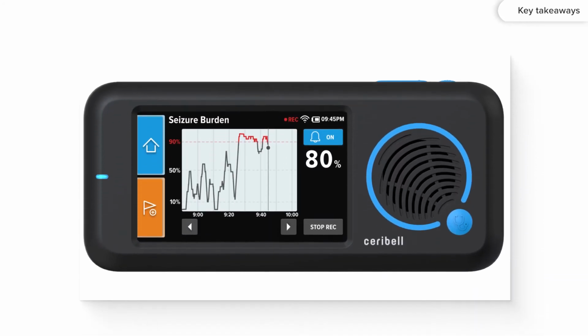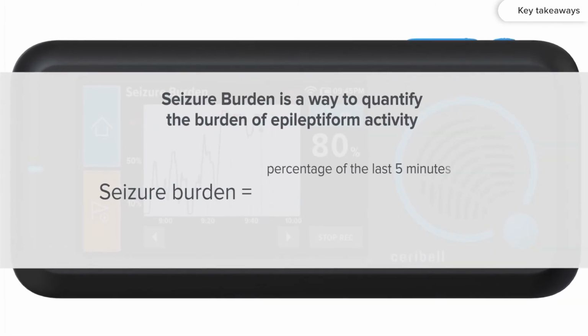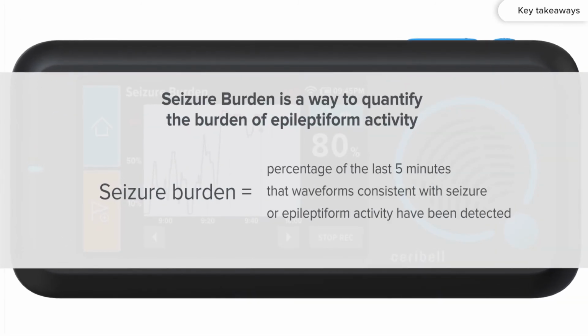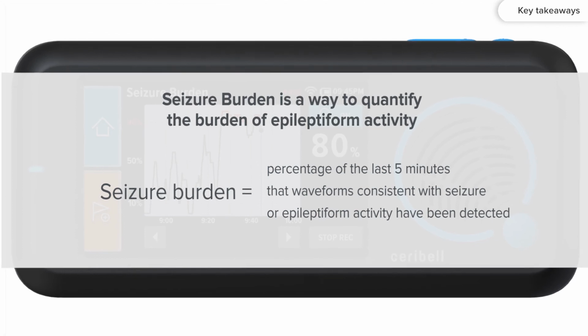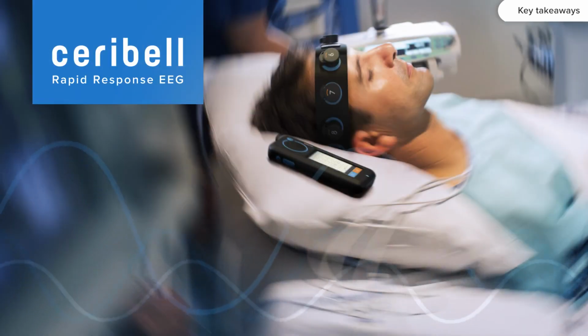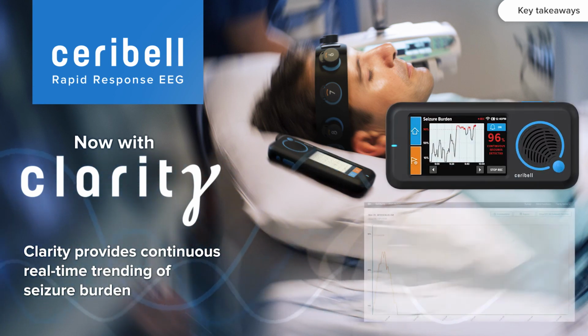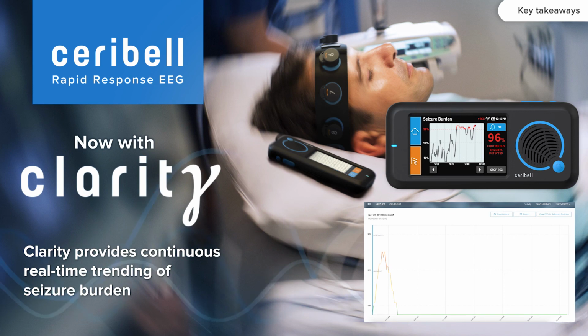Seizure burden is a way to objectively quantify the burden of epileptiform activity. It is the percentage of time this activity has been detected in the last 5 minutes. Seizure burden is updated every 10 seconds for the preceding 5 minutes of the EEG. Clarity is the first tool to provide continuous, real-time quantification and trending of seizure burden, both on the Ceribell recorder and on the Ceribell portal.